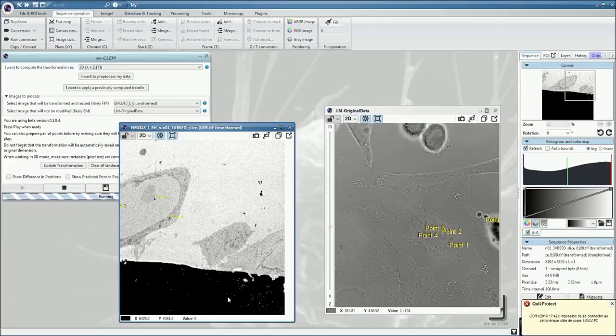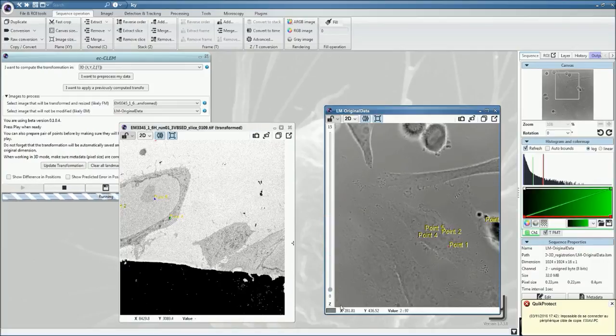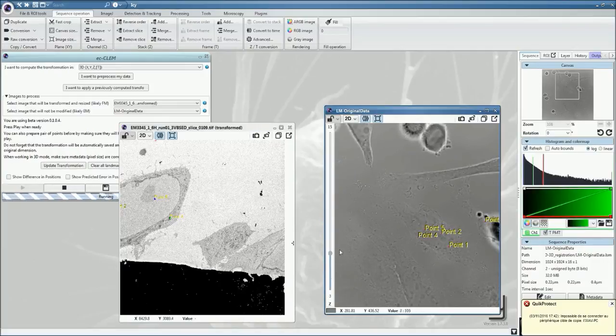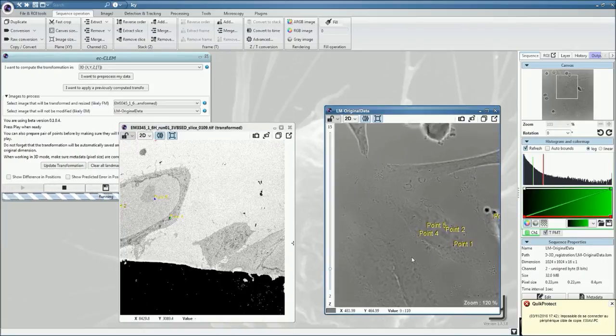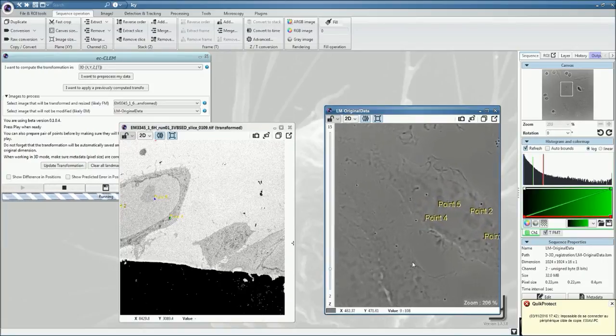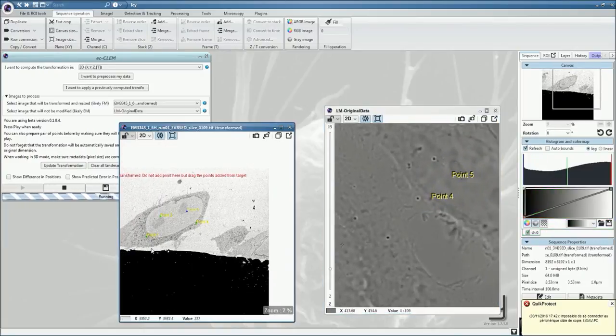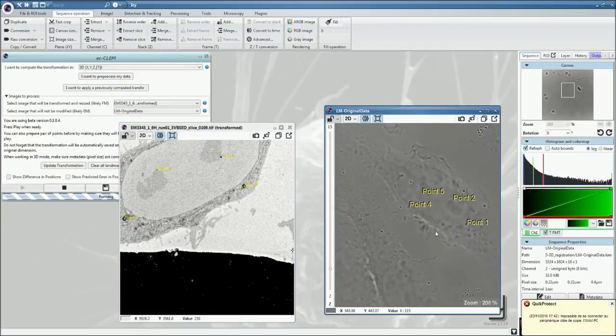Here, in that case, the plane that you see here corresponds to the presence of the coverslip. So any point on this line would correspond to the bottom line of our stack. However, this is not necessarily simple to identify, and therefore you have to look for it carefully.